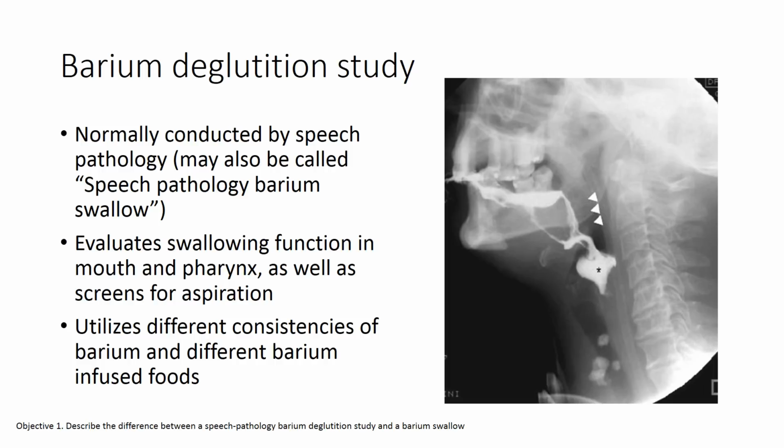Radiologists, in fact, tend to try to avoid this type of study. Not only is it complex and time-consuming, but there's a very good chance that you might get barium spit on your shoes or your trousers, and we kind of like to avoid that whenever we can. So we leave this to the speech pathologists.